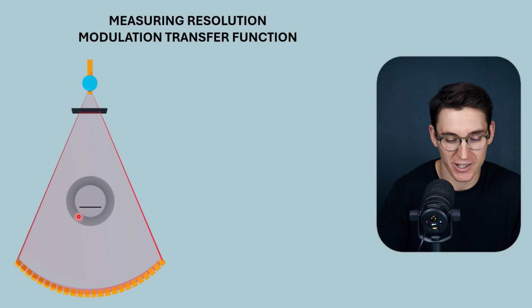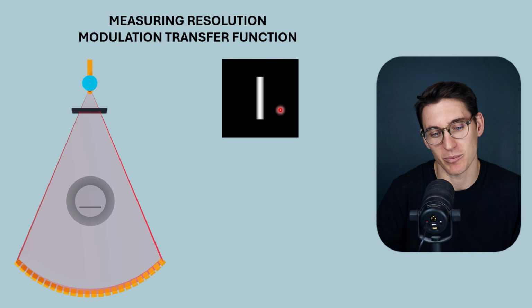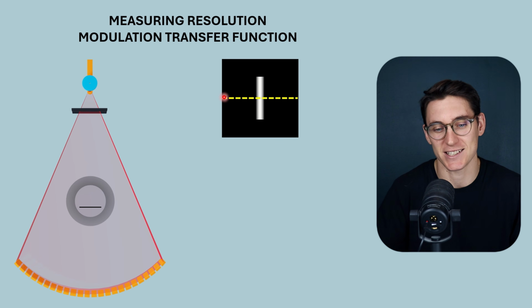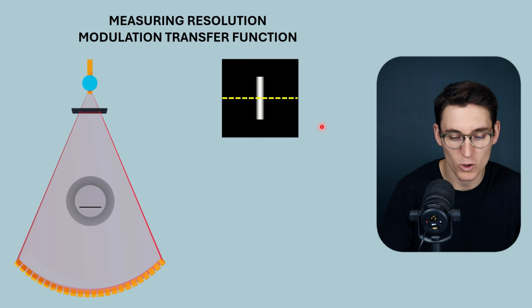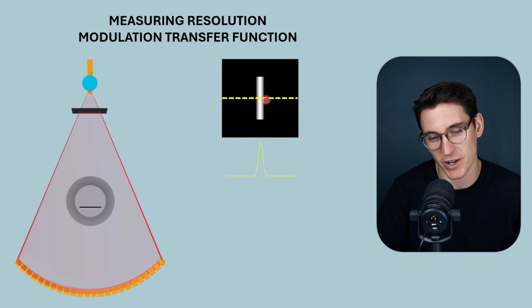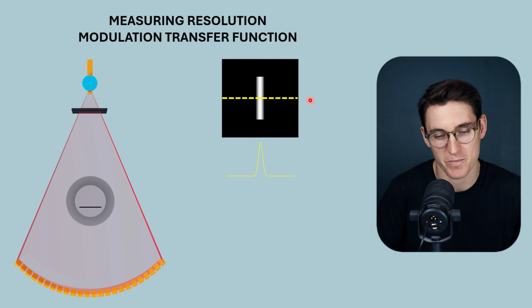And we can acquire an image and reconstruct that image and display it on our screens here. Now this is the highly attenuating rod here. It's got high Hounsfield unit values allocated to it. We can take a cross-section of this image and plot the intensity values that have created this image along this cross-section. This is now going to be in the x-axis of our scan. We can plot that here, and we've made a graph that represents the attenuation values across this specific line.